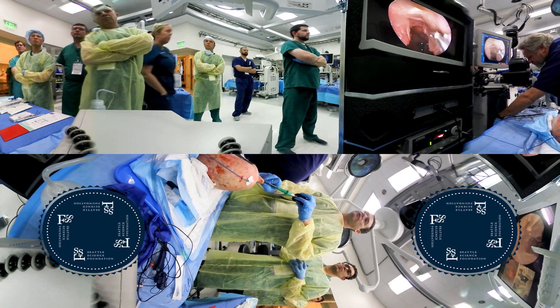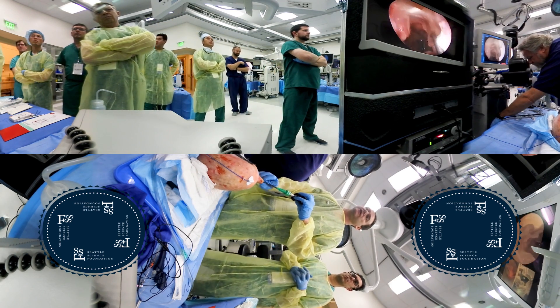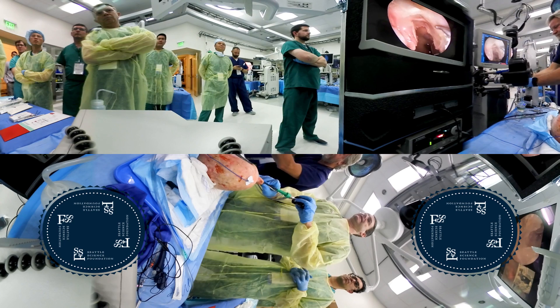As the bone gets hard rather than continuing to fracture, come back in with your diamond drill and drill down this part here. I'm not going to do it today — we're just going to try to get around the corner.